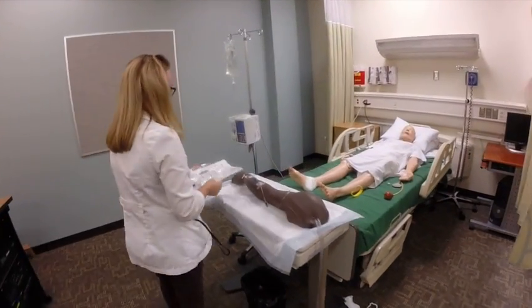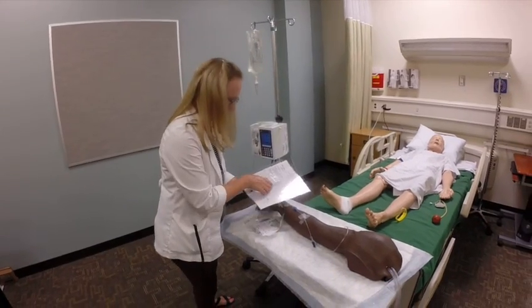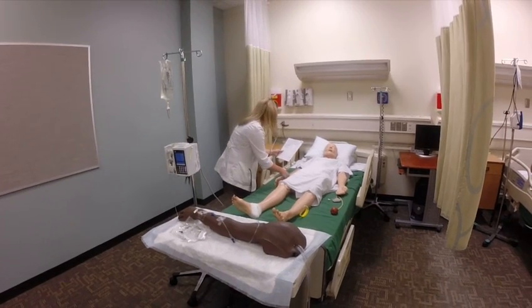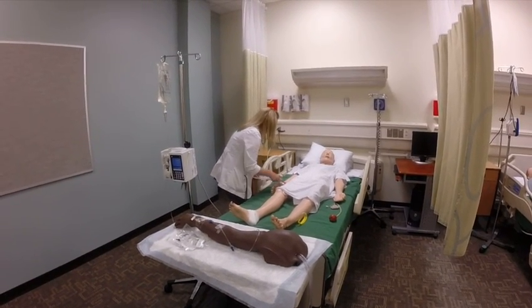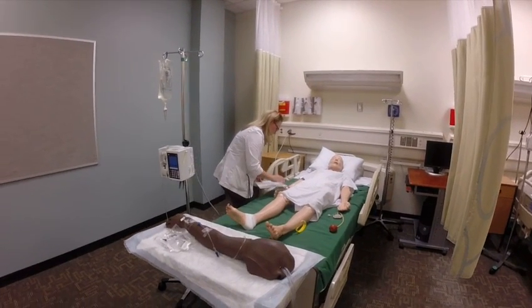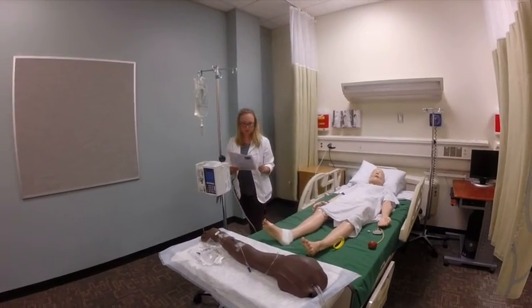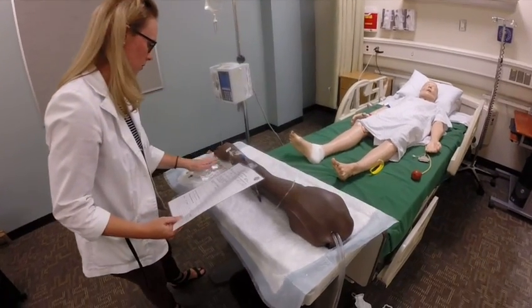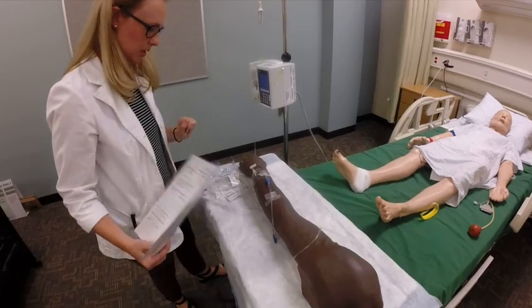Hello, Mr. Imahurt. I'm back with that antibiotic I told you I was going to grab. Just for safety, I'm going to make sure I'm correct. Can you tell me your name and date of birth? Alright, check my MRN number — 88109530. Do you have any allergies? No? Okay, that's what I remember. So this antibiotic — I'm hanging Primaxin. You had this earlier. We're just trying to take care of that infection.